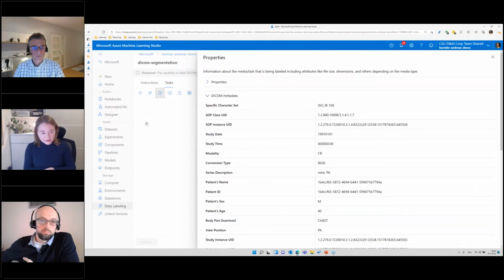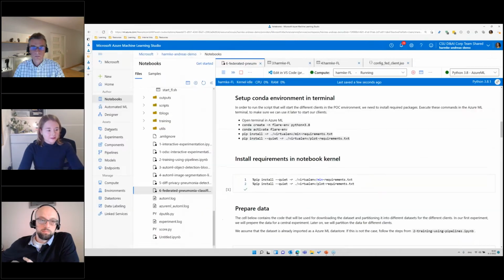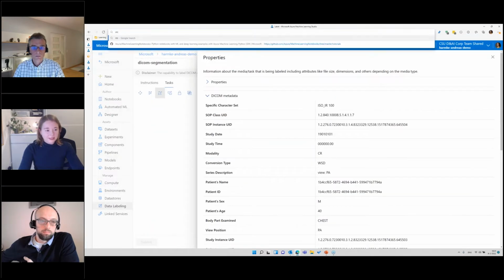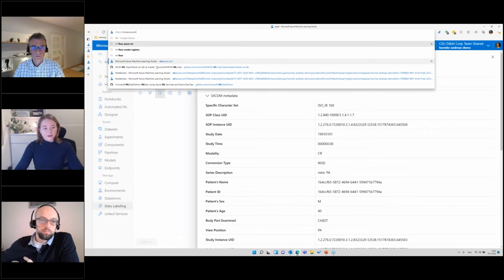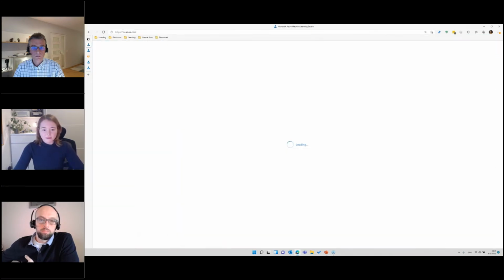A different feature that can be very interesting for medical imaging is that quality control is also coming up. And what this feature will entail is that as a project manager, you can basically identify some of the rules that are necessary in order to accept a label.